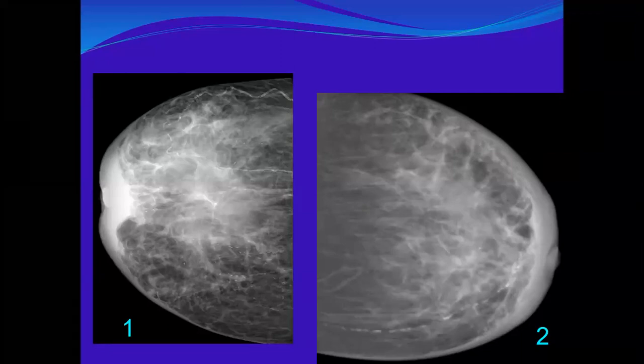And about the other breast, there is diffuse edema of the breast in form of thick trabeculation and diffuse skin thickening. No underlying mass seen, and there is vascular calcification. Most patients have calcifications, okay. This is benign vascular calcification of the left breast. The right one also has vascular calcifications.